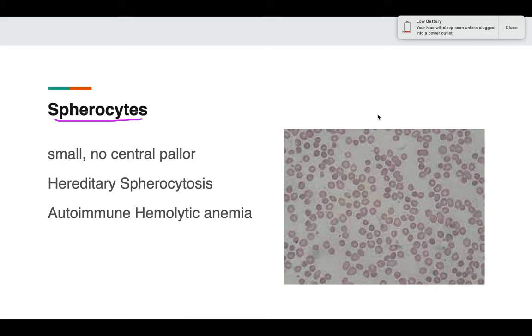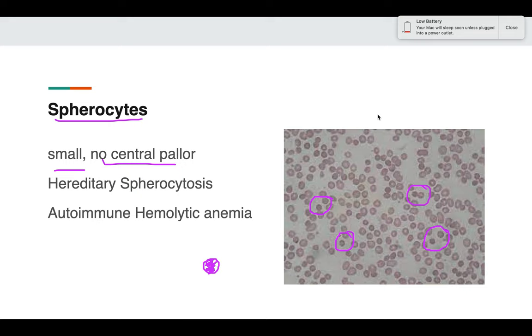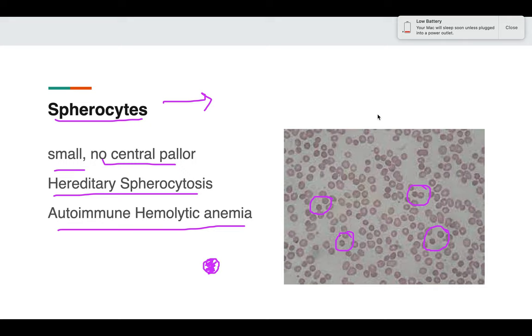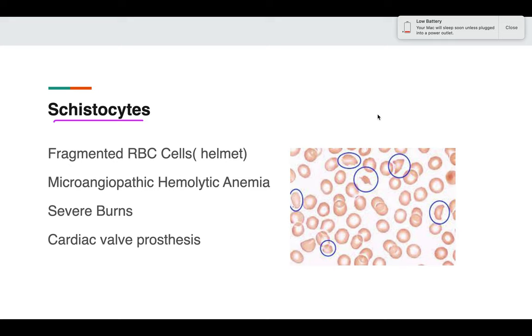In spherocytes, the difference from a normal RBC is that the spherocyte will be slightly smaller in size and will have no central pallor. You can see many RBCs that are small but not microcytes, because they have no central pallor — these are spherocytes. They are seen in hereditary spherocytosis and autoimmune hemolytic anemia. When giving a diagnosis of spherocytes, always correlate with the history of the patient.